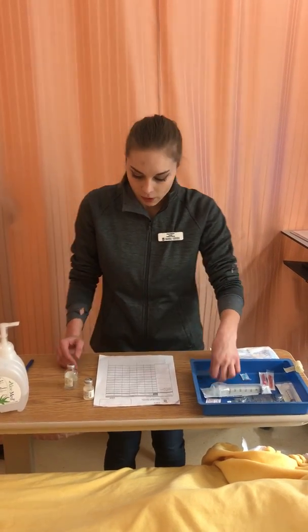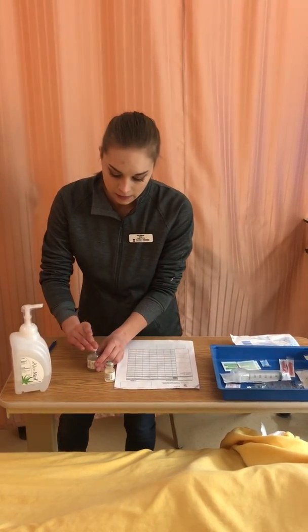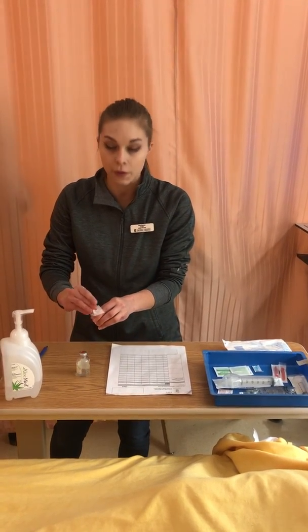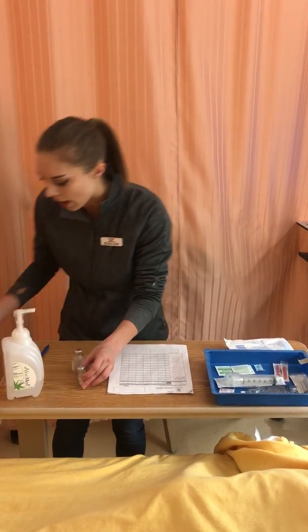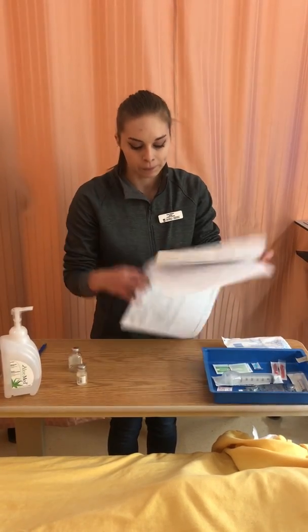So now I'm going to swab the tops of my vials. And here I have the 2 gram vial, which is what I have. For 30 seconds, and then I'm going to let them dry. As I'm letting them dry, I can read my drug monograph.